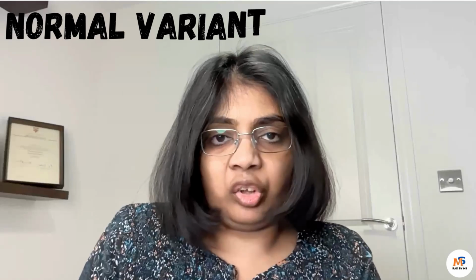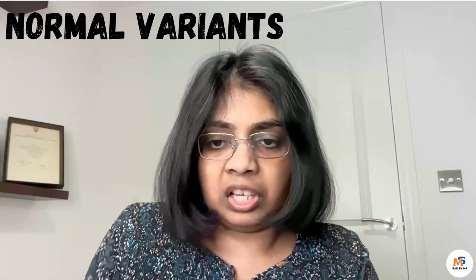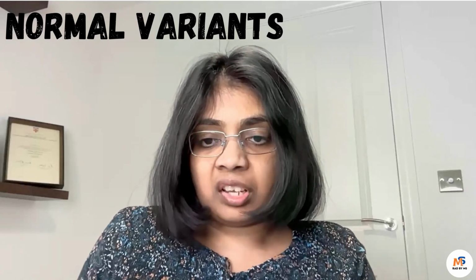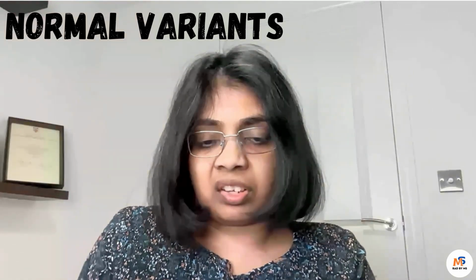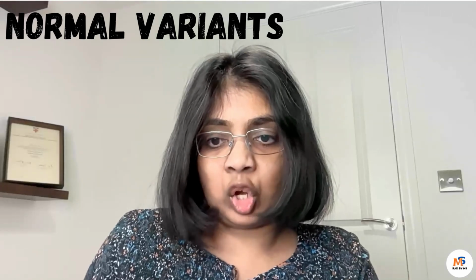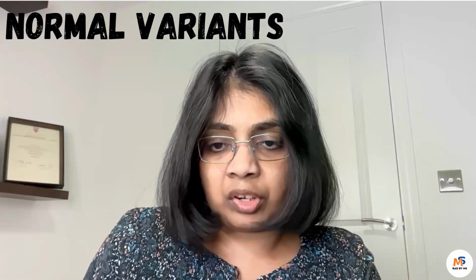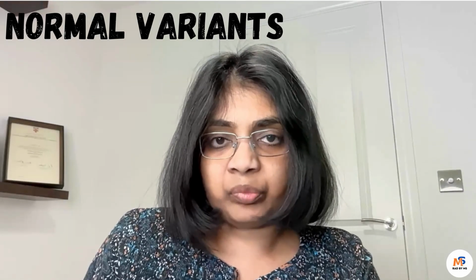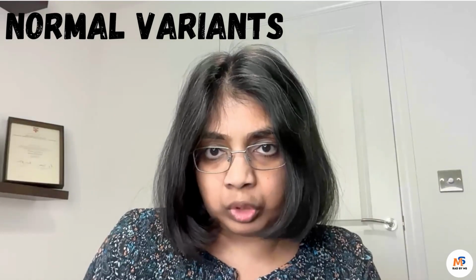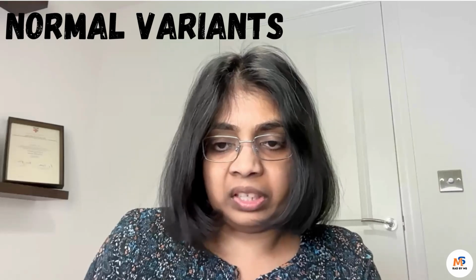Okay, so this is our final topic in looking at the anatomy of the chest radiograph. The final thing that I want to look at is normal variants. It's a common anatomy question in the part 1 exam. So I'd like to spend a couple of minutes talking about a couple of normal variants that you may see.